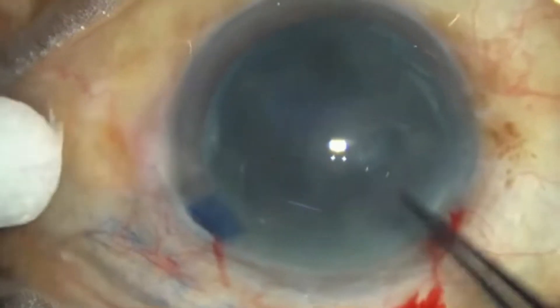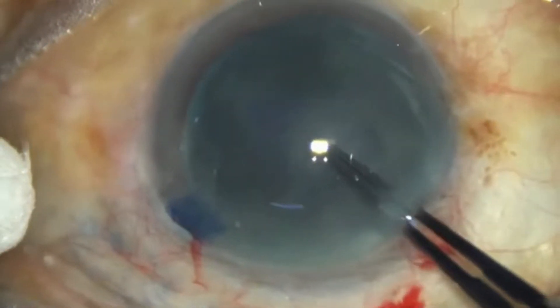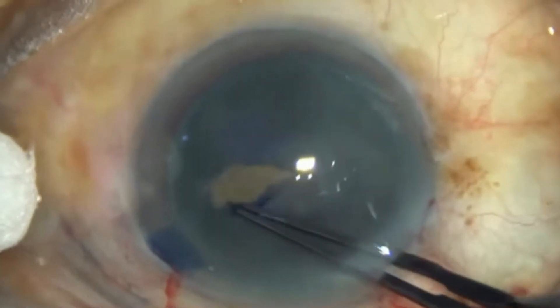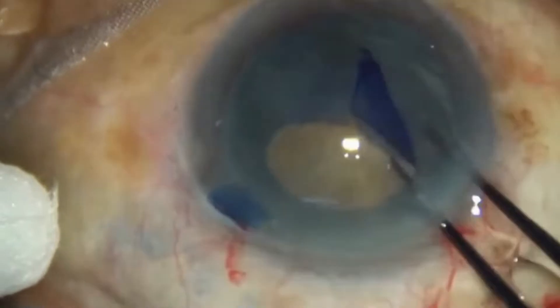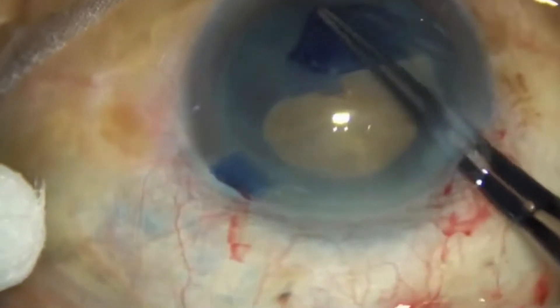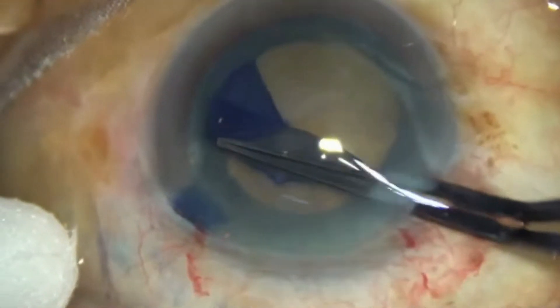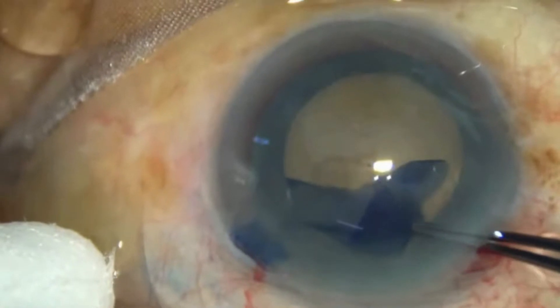Capsulorrhexis is a circular, central, curvilinear opening in the anterior capsule, created with a sub-incisional needle puncture. It is then completed with arcuate shearing taken in clockwise and anticlockwise directions.